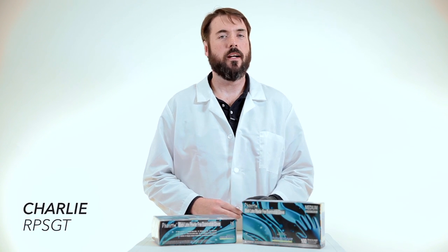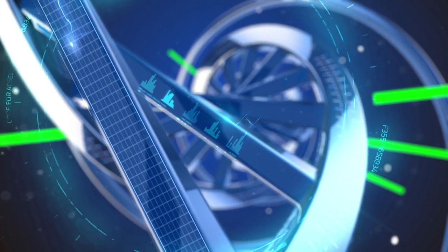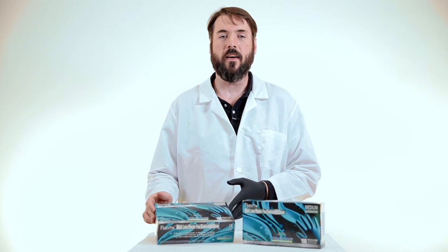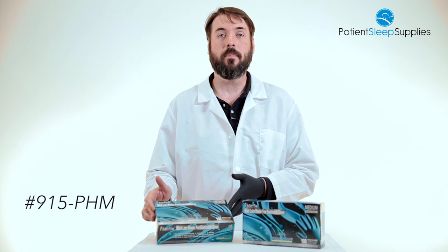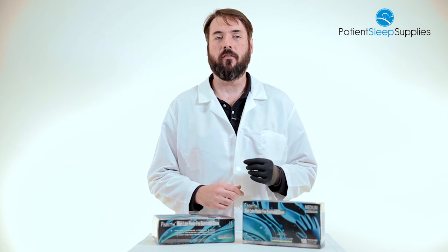Hello everyone, it's Charlie here, your medical supply specialist with another FYI product video. Today we're talking about the Phantom Black Powder-Free Latex Gloves, product number 915-PHM. These are a disposable black latex glove for medical use.